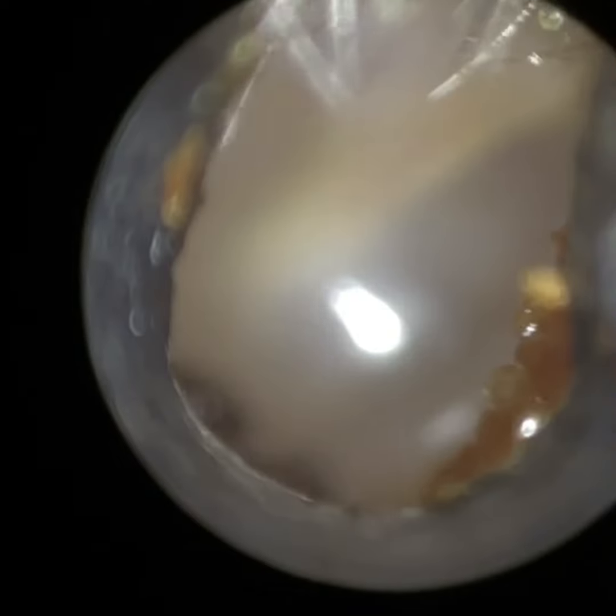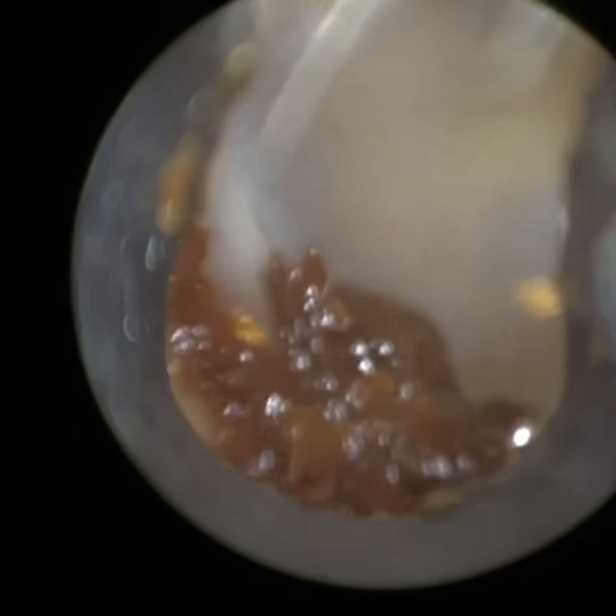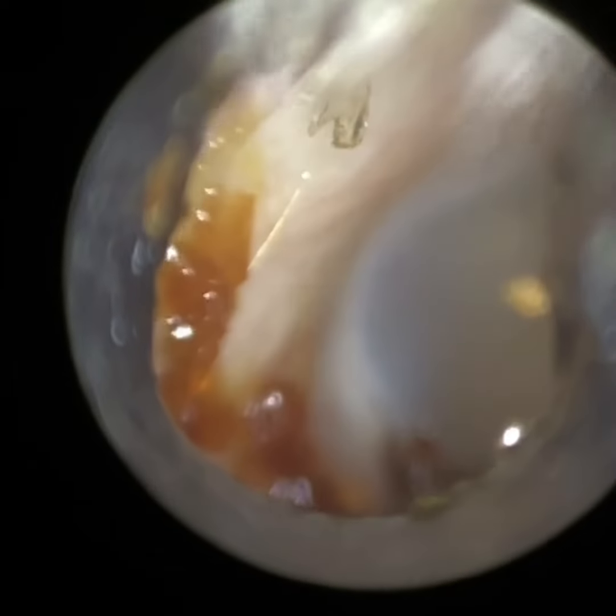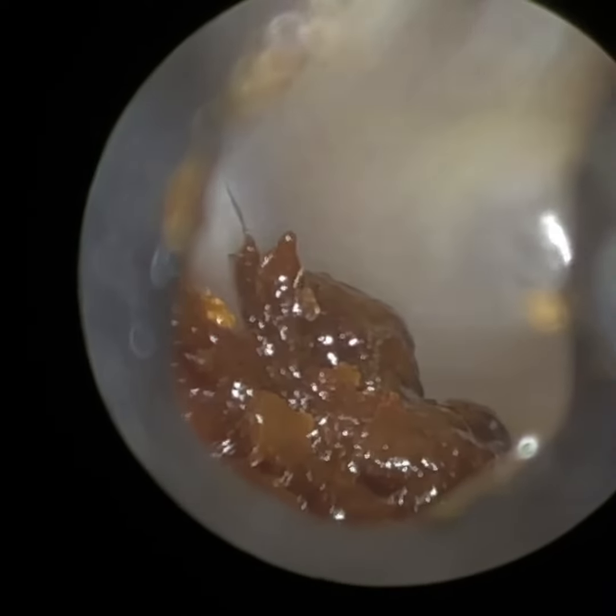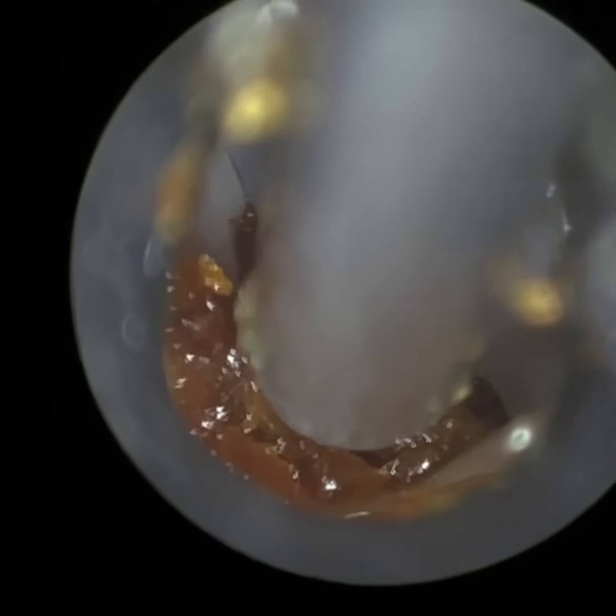At this stage we're entering the ear a bit deeper, just dilating the ear canal and straightening it. You can see it's near the eardrum, so we're going to put the suction probe in — it just blocked the suction probe and we're at risk of pushing it further in. So I just came back out. It is right up against the eardrum, in the isthmus region. You can see the wax is actually on the annulus, which is the fibrous cartilage outer ring that gives the eardrum its tension and strength. I went from a higher angle there to get a better suction grip, as opposed to more horizontal where I could potentially push it even further.